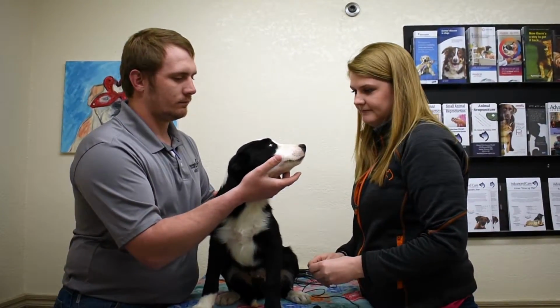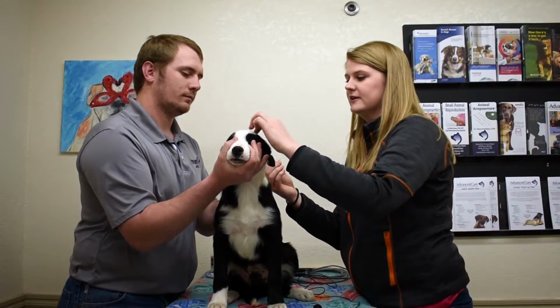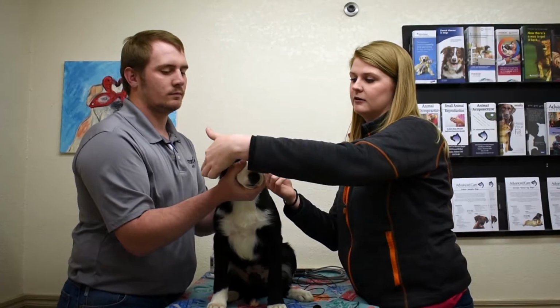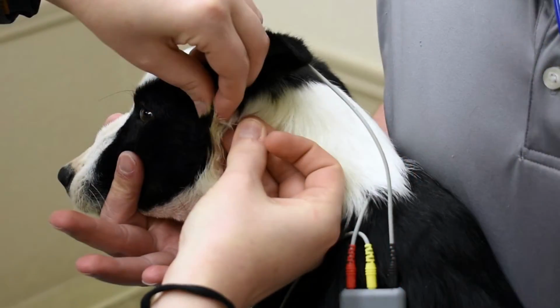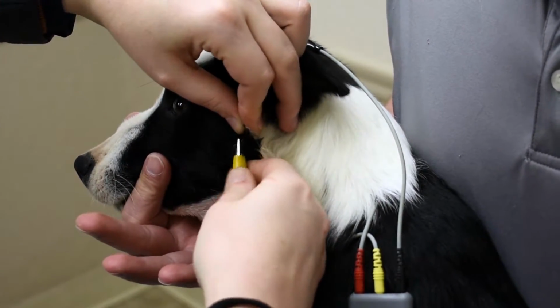All right, Woodrow, I know. So there's 3 places for our particular unit that they want you to put the leads. So one is right here on the top of their head, and then right underneath the ear on either side. So the leads all coordinate with a specific place. So the black lead goes on top.